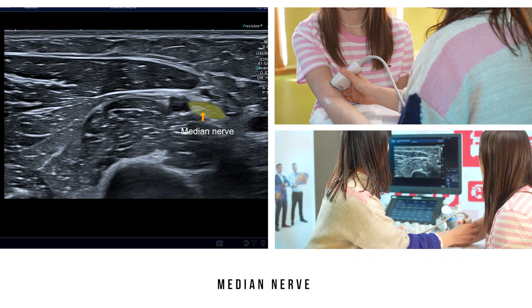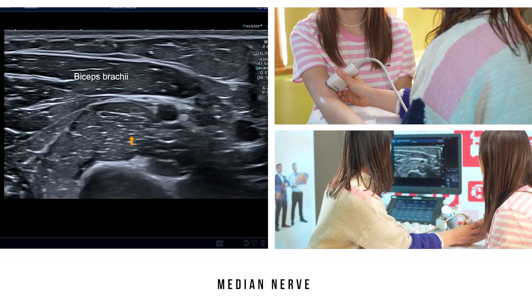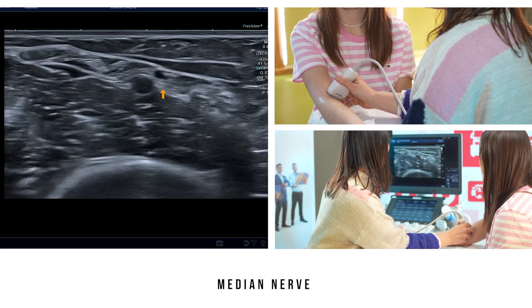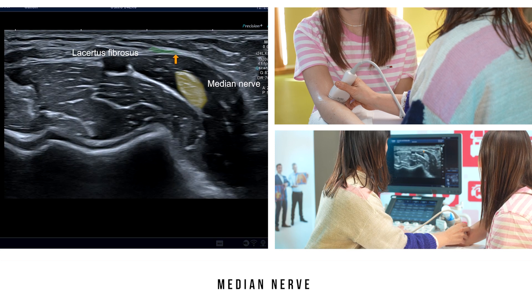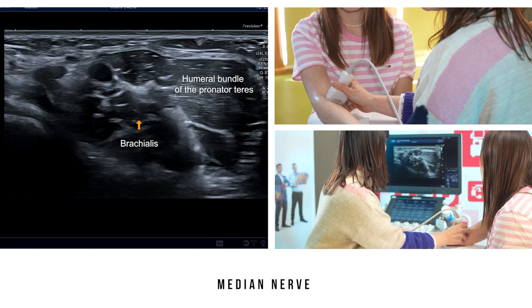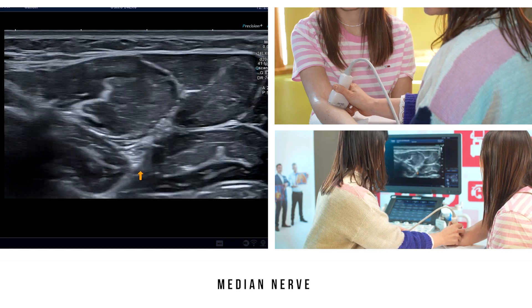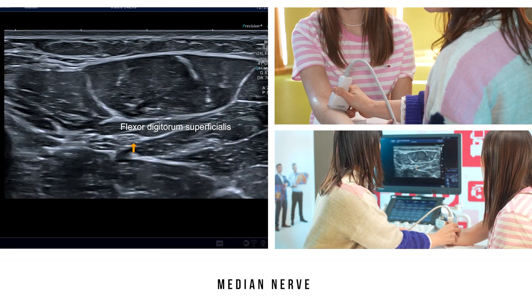During the analysis of the anterior aspect of the elbow, we will also analyse the median nerve. In the middle third of the arm, the median nerve follows the humeral artery between the biceps brachii muscle superficially and the brachialis muscle deeply. At the musculotendinous junction of the biceps brachii, the median nerve will be covered by the lacertus fibrosus. It will then continue distally, where it is first covered by the humeral bundle of the pronator teres — with the brachialis muscle still visible in the deep layer — then passes between the two bundles of the pronator teres (humeral bundle superficially and ulnar bundle deeply), and finally passes under the arcade of the flexor digitorum superficialis.